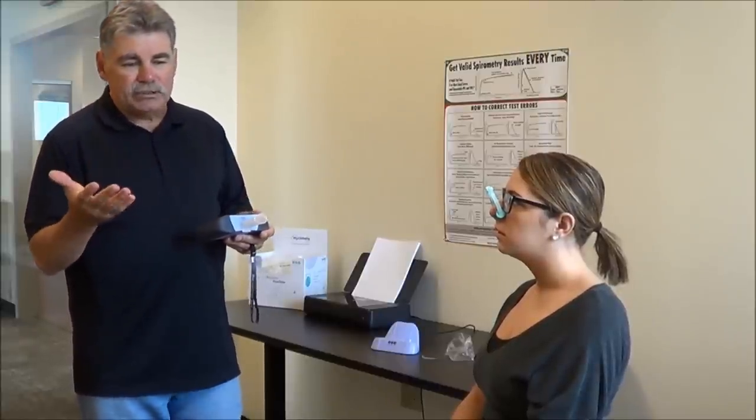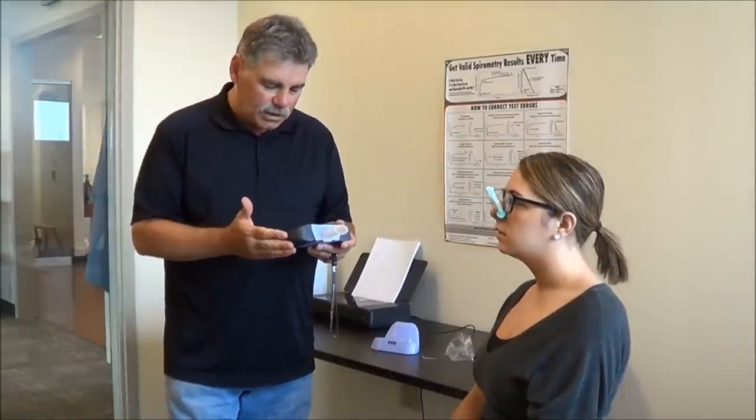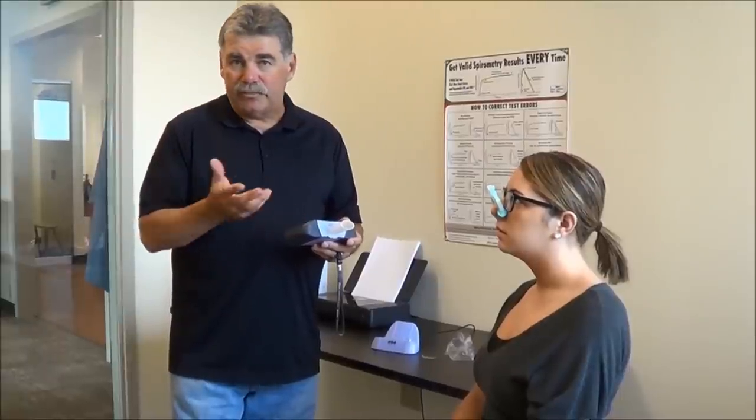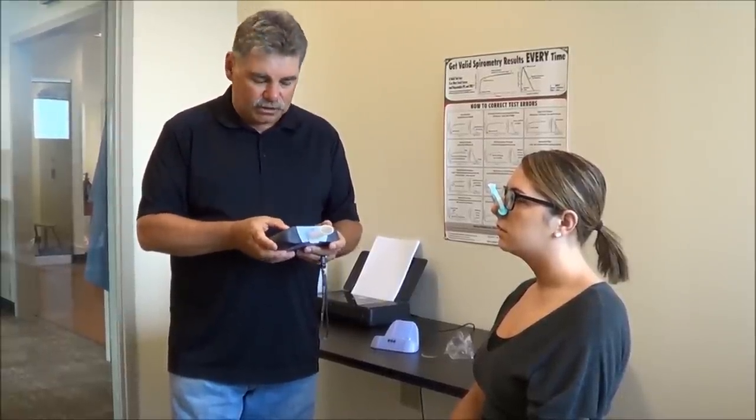As I mentioned, we need three acceptable trials. So far we have one. I have the options of add trial and data, data meaning I can look at the more detailed data, or I'm ready for the second blow.